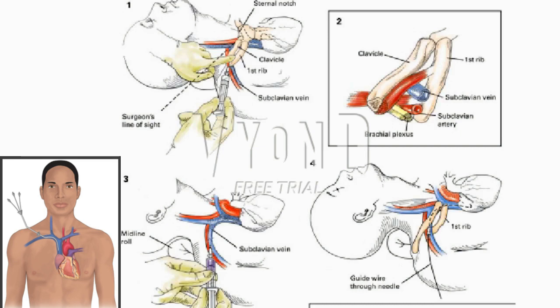The patient is placed in the supine position and the arms are tucked at each side. Fluoroscopy should be available. The hair is removed with clippers. Each side of the neck and upper thorax are prepped and draped using the maximum sterile barrier technique.